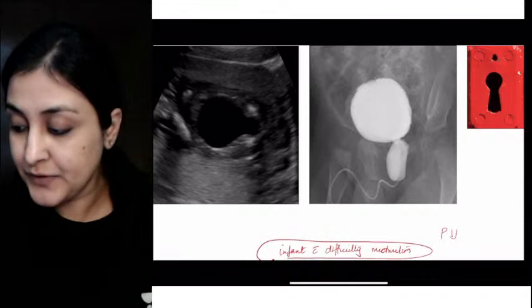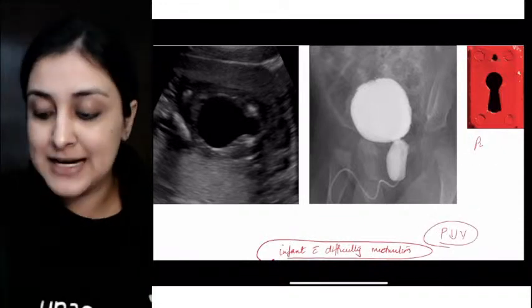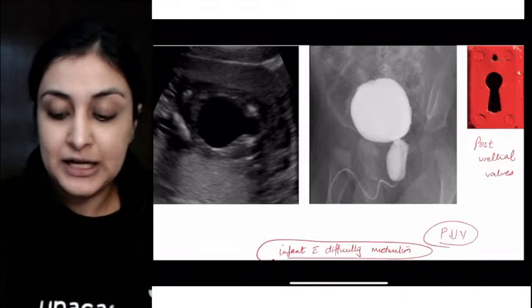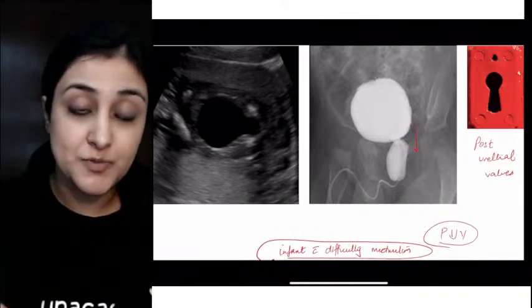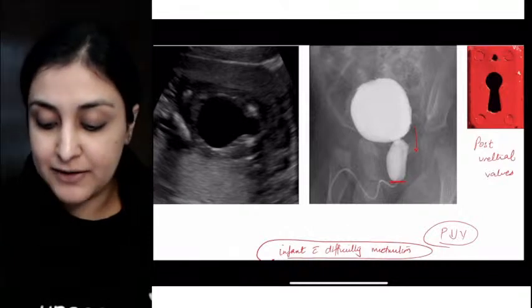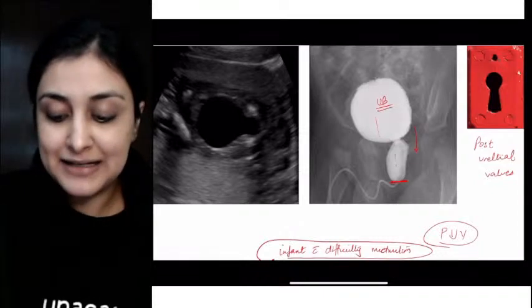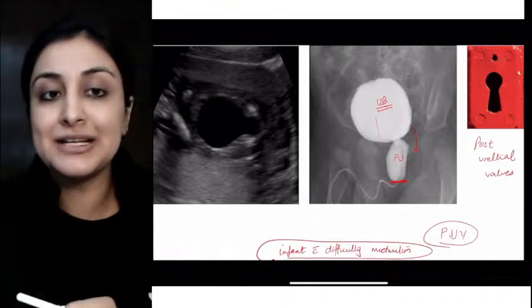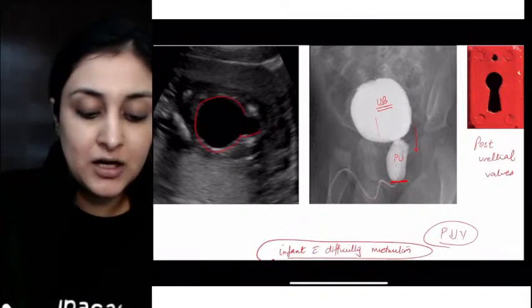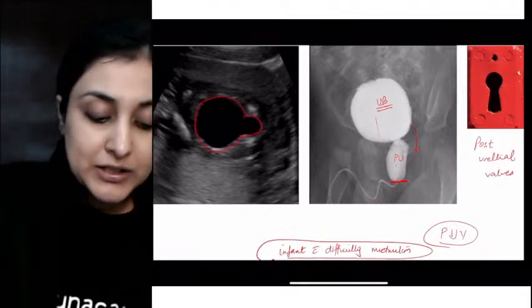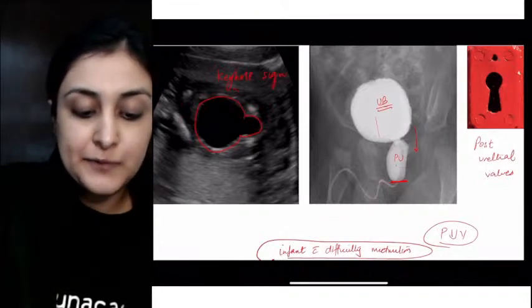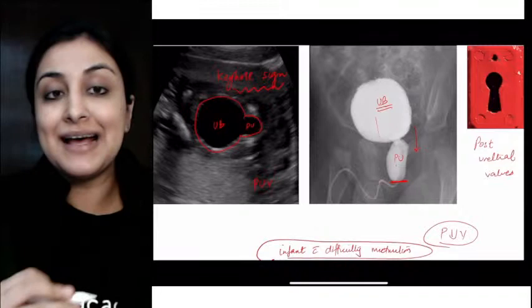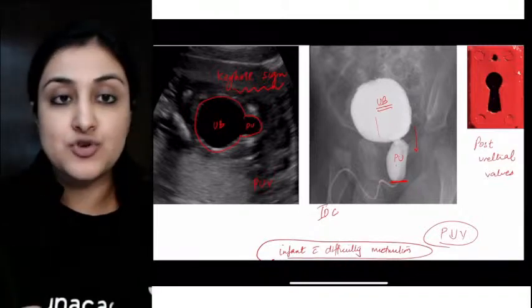Posterior urethral valves means there are these one-way valves which stop the flow of urine from going from top to bottom. So what will happen? There will be obstruction. Do you agree if there are valves here? The urinary bladder will be dilated. Posterior urethra will be dilated. And then I will see this tapering. This can be picked up on antenatal ultrasound. This is an antenatal ultrasound showing a keyhole sign. Do you see the similarity with a keyhole? This is called a keyhole sign in posterior urethral valves wherein you see the urinary bladder and posterior urethra being dilated.